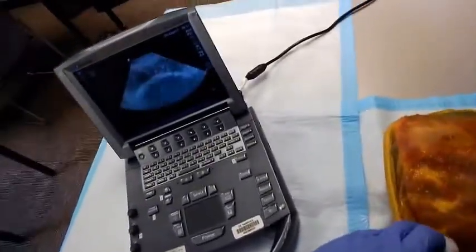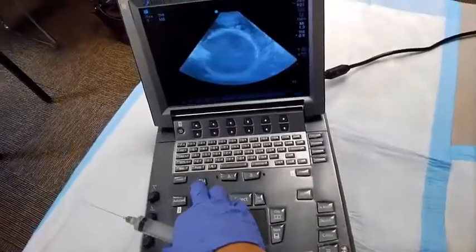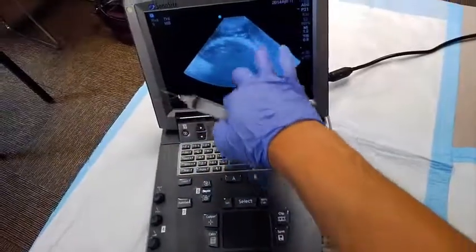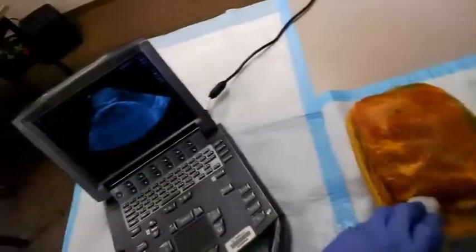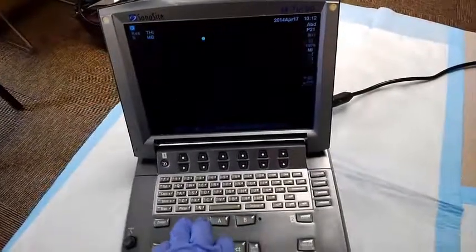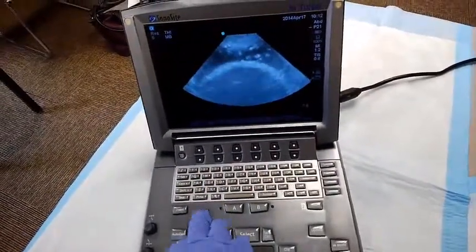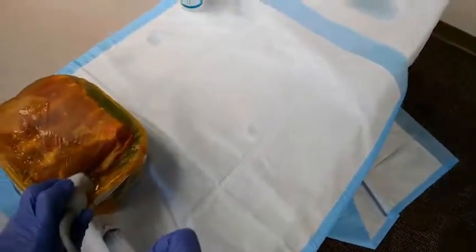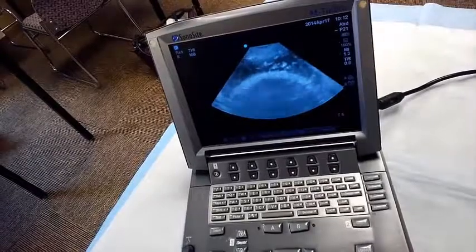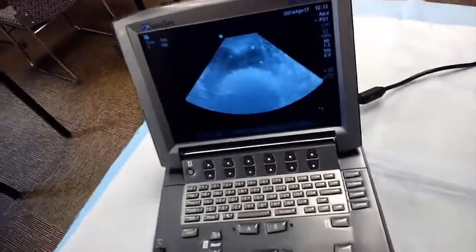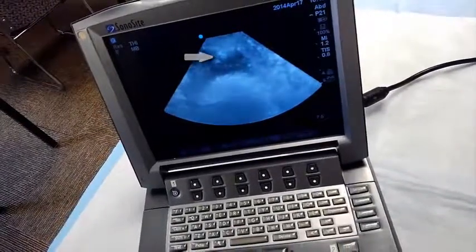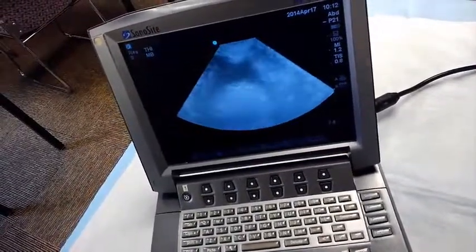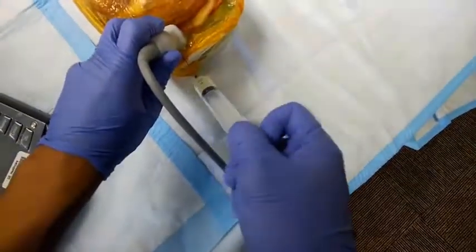This can also be used for a sub-xiphoid view — placing the probe in the sub-xiphoid space. When we're looking at the ultrasound, you can see the heart; this would be the pericardial effusion. We'll take our needle, placing it underneath the probe in the area of interest where we'd like to get some pericardial fluid. Placing my needle underneath the probe — right there, you can see the needle jabbing through — and I'm through, and I'm able to draw pericardial fluid.